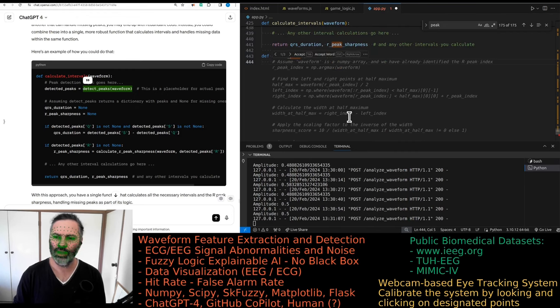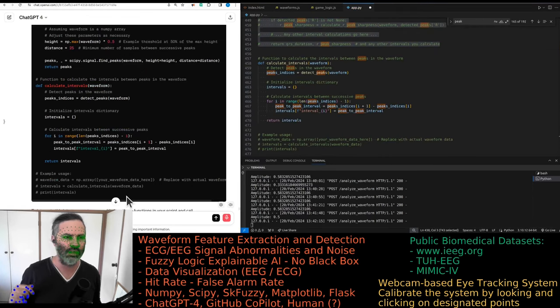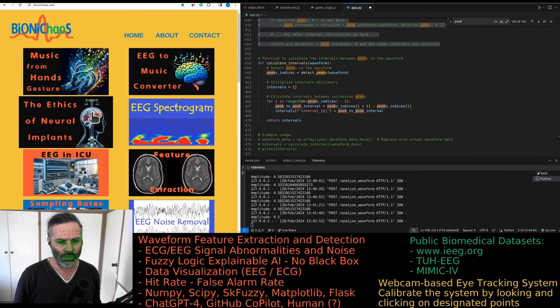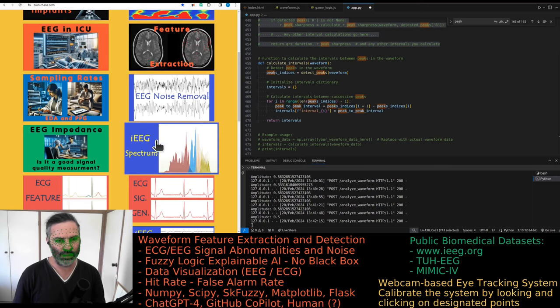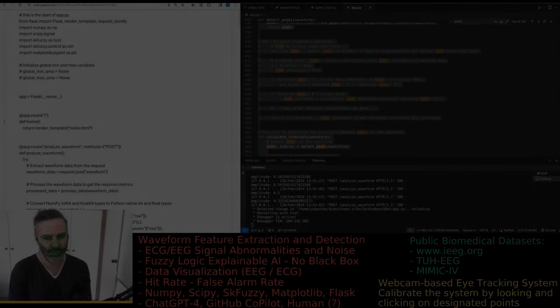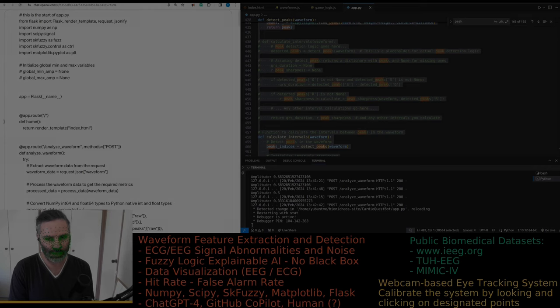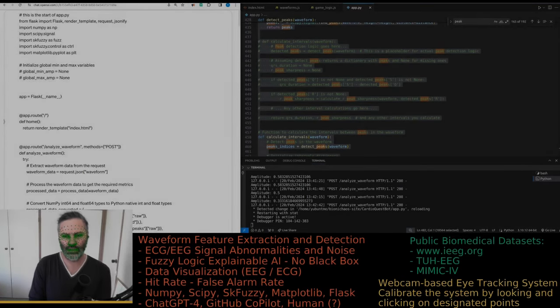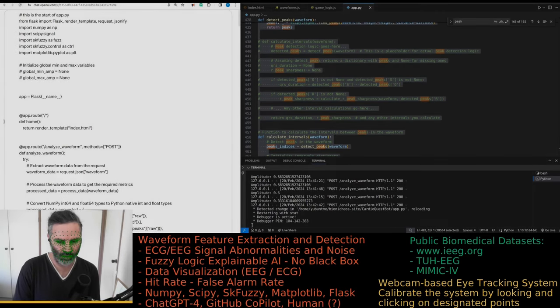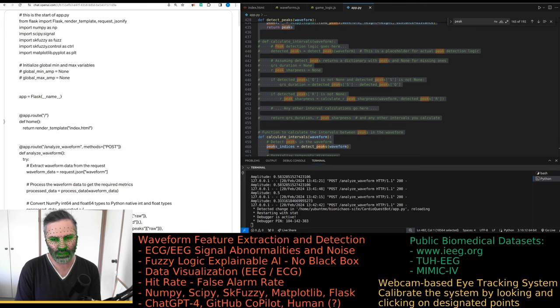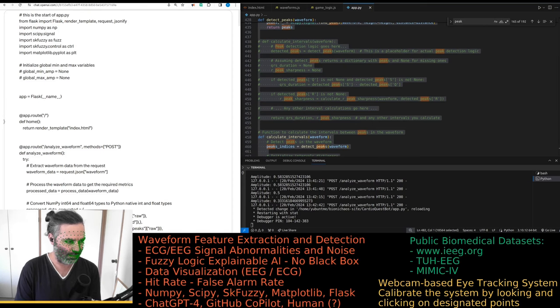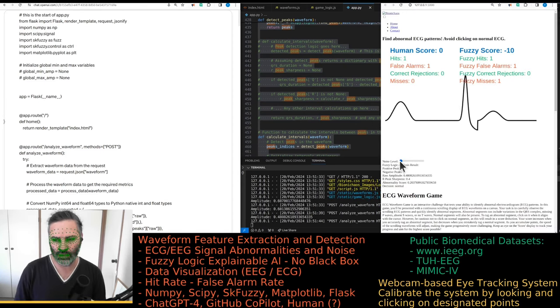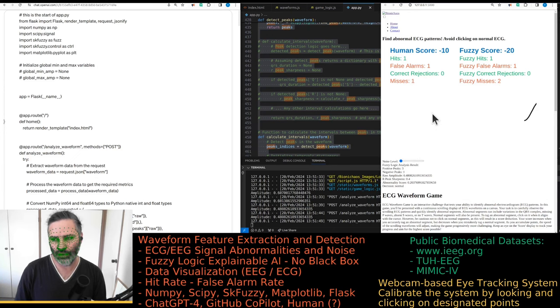Copilot, do anything useful? By the way, just a reminder, all the tools we make are available on bionicas.com. Go check them out and don't forget to leave your comments. A couple of things with the code that we currently have, we need to fix it and integrate it properly. Can you help with that?